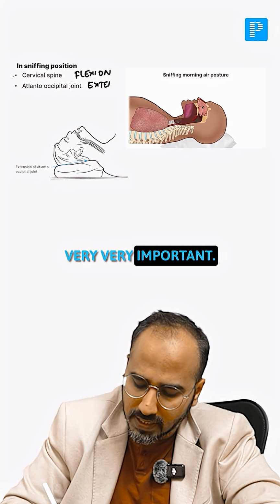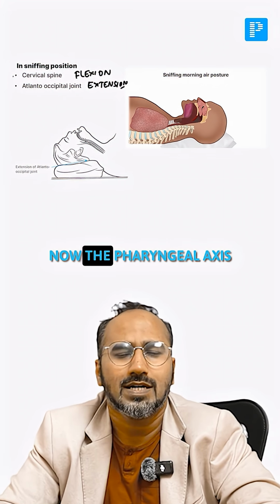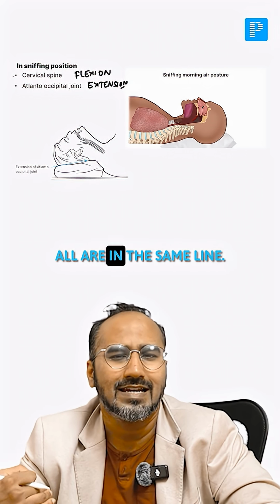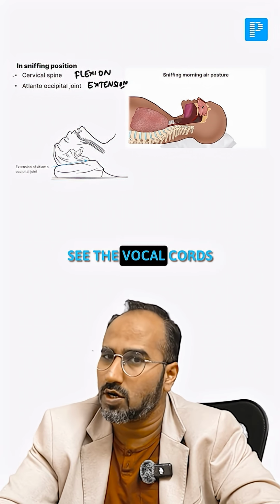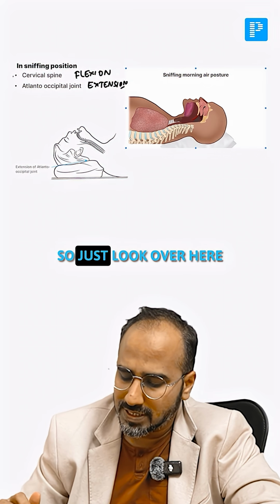Very, very important. After you make the patient lie down in this position, now the pharyngeal axis and the laryngeal axis and the oral axis are all in the same line, and you can easily see the vocal cords when you intubate. So this is the position used. So just look over here, guys.